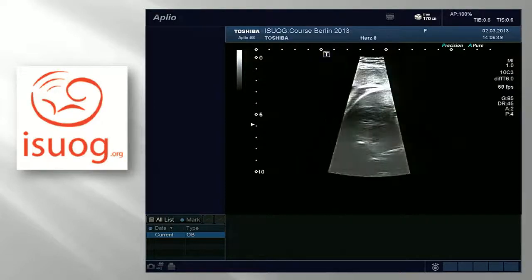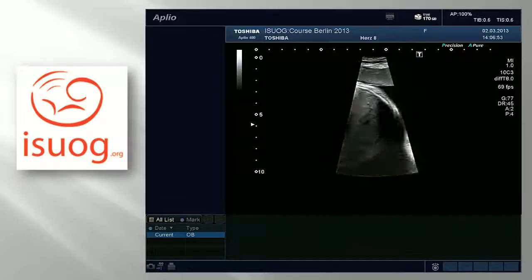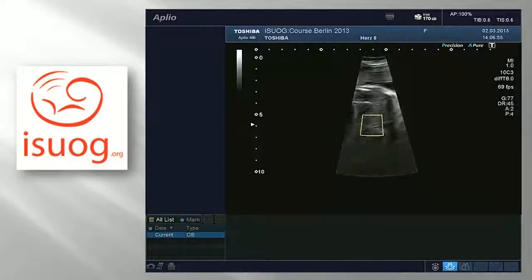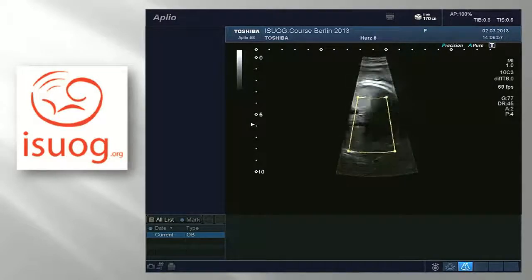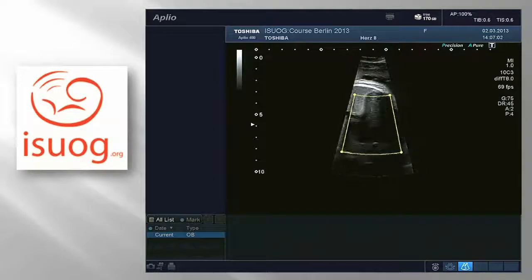Because of all the color settings in it. Let me change right from left again. Do you have a microphone or no? Is it live there already?